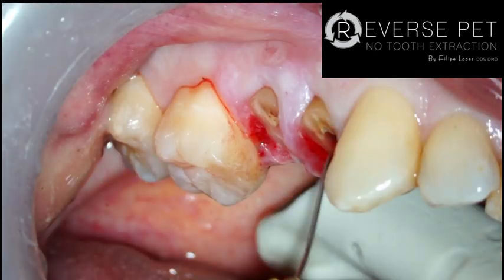These burrs are absolutely amazing for this because they are long burrs and they are very sharp. So it's diamond burrs, and you establish your entry point, and you can go even further, drilling simultaneously not only tooth but also bone, and establish a good direction for your implant site.